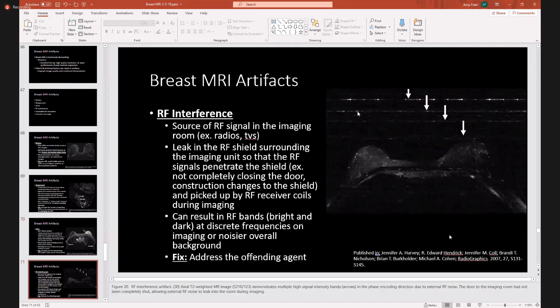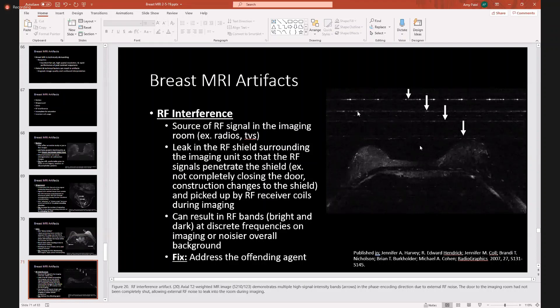RF interference occurs when there is some sort of interference in the imaging room — is there a radio on, a TV, or did the door not get closed all the way? Essentially, you get a leak in the RF shield that surrounds the imaging unit, so RF signals penetrate the shield, and you get bright and dark RF bands. To fix it, you need to address the offending agent: make sure the door is closed properly and that any radio or TV is off.